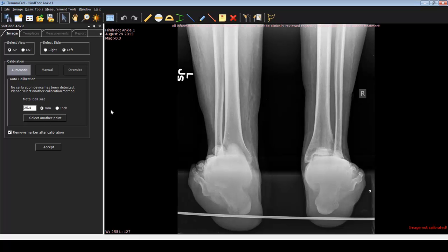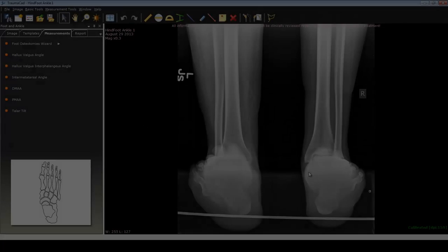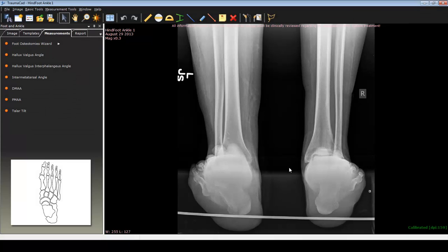The next part we cannot do because we have not placed a calibration marker on here. So how do we adjust for that? The program allows you to do it manually, and you can pick a point. If you know a certain measurement that you like and want to calibrate to, you can use that. Many of you that perform trauma would be familiar with the fibula having a relatively certain measurement when you put screws in, and that could be one option. So once we're done calibrating our image using the other features, we can go ahead and start deformity planning.